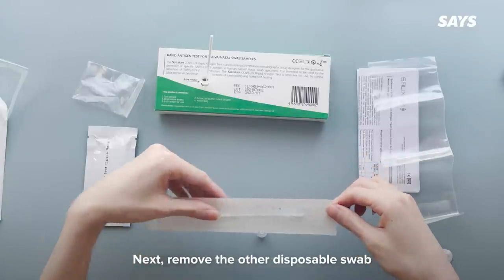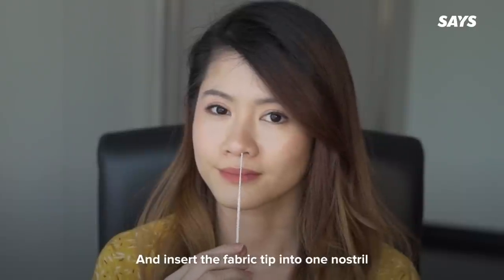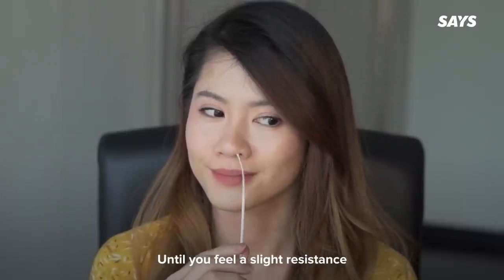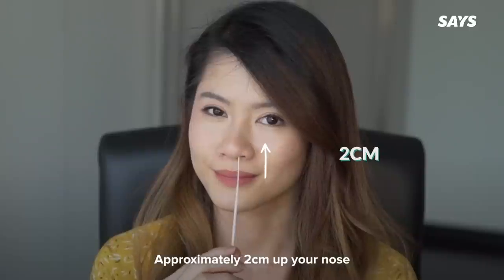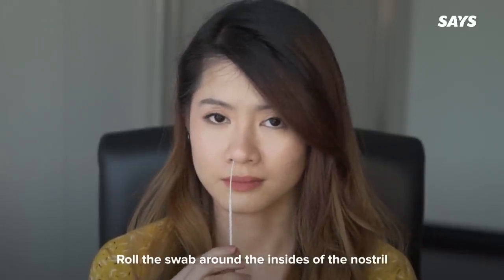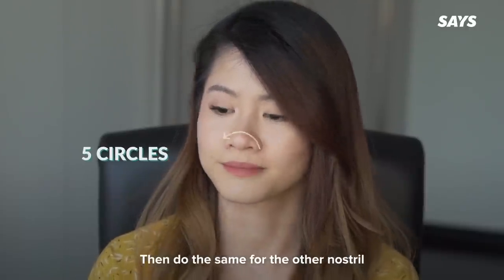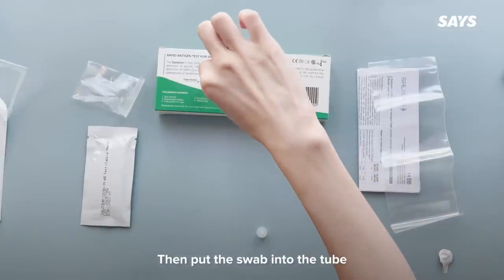Remove the other disposable swab and insert the fabric tip into one nostril until you feel a slight resistance, approximately two centimeters up your nose. Roll the swab around the insides of the nostril, making five complete circles. Then do the same for the other nostril, and put the swab into the tube.